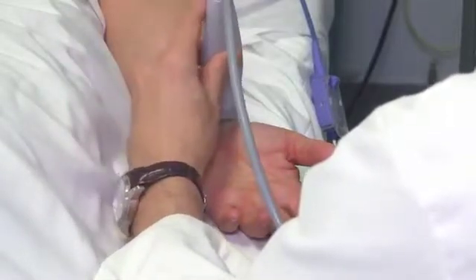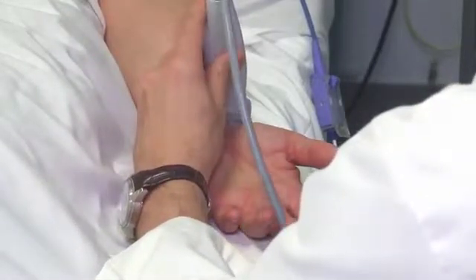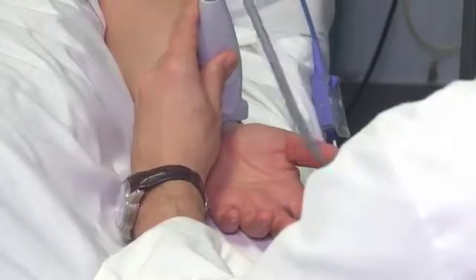There's gel on the tip. We're just going to scan your wrist exactly in the area where we should access the radial artery.